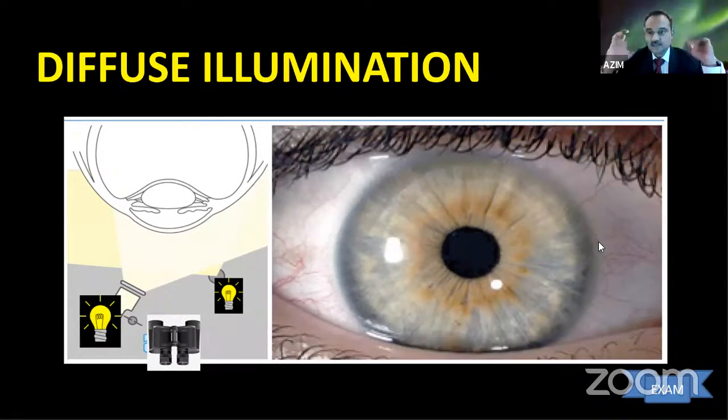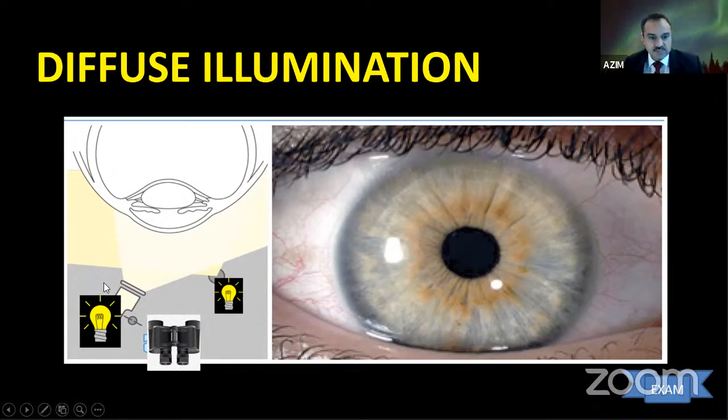Okay, so diffuse illumination. How does it work? It's like a torchlight. If you want to use a torchlight to see the eye, this exactly is diffuse illumination. This is a view from the top. This is how I placed it. If you view it from the top, this is where your eyepiece and head is going to be. This is where your light is going to be.